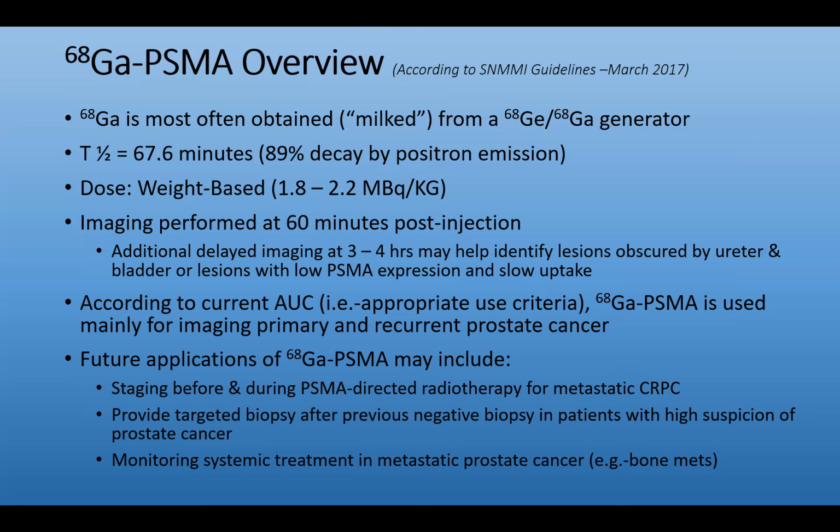But if they don't get the needle in the right place, the biopsy may come back negative. And yet the patient obviously has a high suspicion of prostate cancer. So imaging with gallium PSMA may help guide the biopsy needle to ensure that it's being inserted into an area that has active disease.